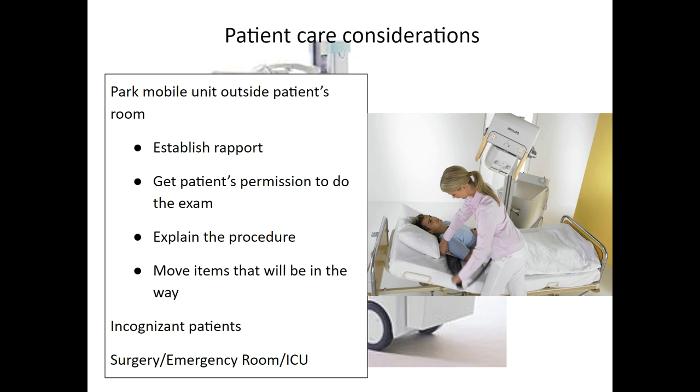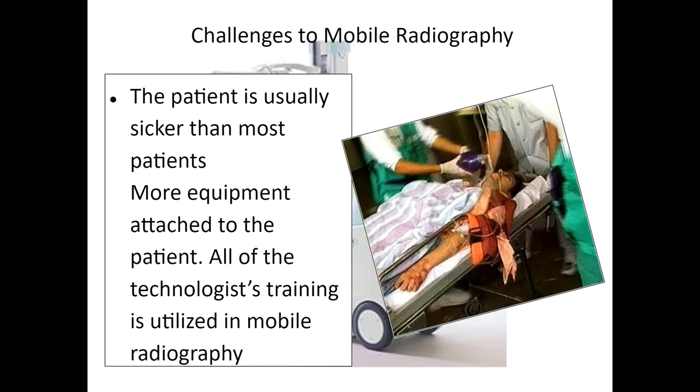Unlike our portable quiz, which isn't quite fair, what would be more fair but harder for you in actuality is if you had a patient and you hadn't x-rayed them, you know, 10 times in open lab and know exactly what you can do with the size cassette you have, right? When you have the unknown, it's much easier to cut a costophrenic angle or an apex.